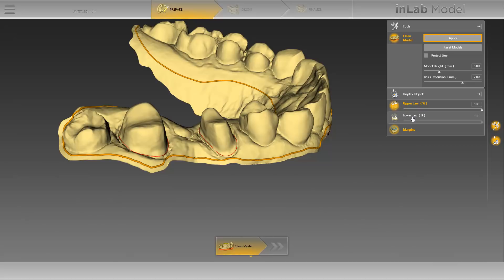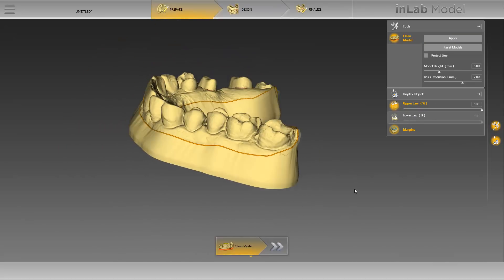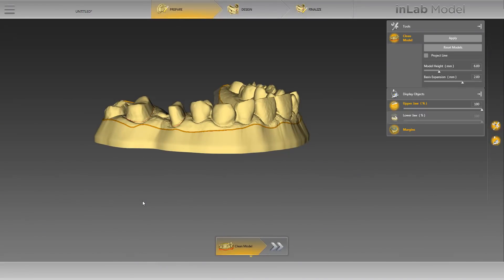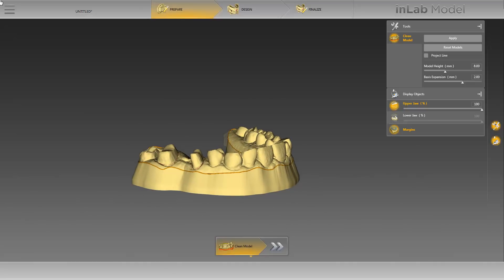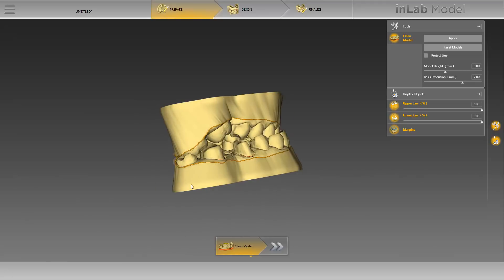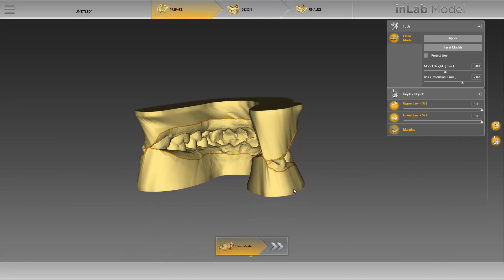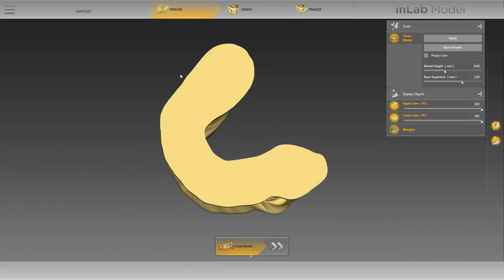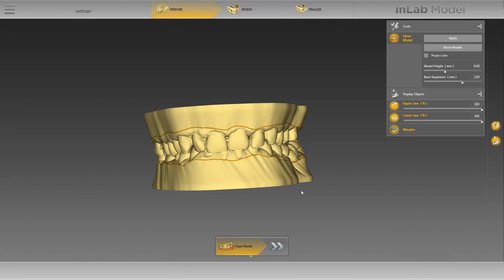Clicking on Apply will start the calculation. After creating the model, you can still change the height or width of the base. As an example, we will change the height to 8 mm and recalculate the model. The calculation has also been performed for the opposite jaw. We will activate the lower jaw and check the models from different angles. Without making any further adjustments, we will move to the next phase, the design phase, by clicking on the double arrow.